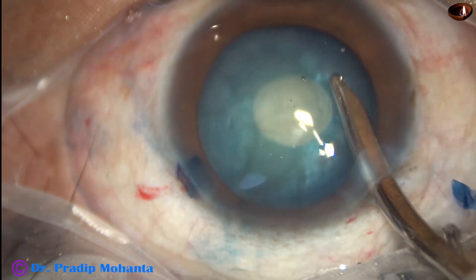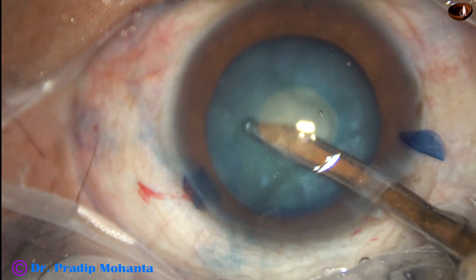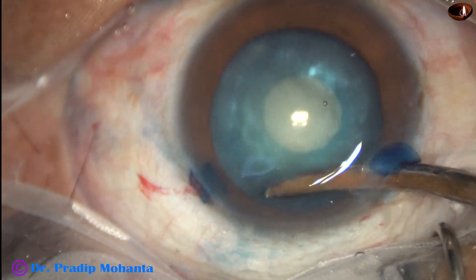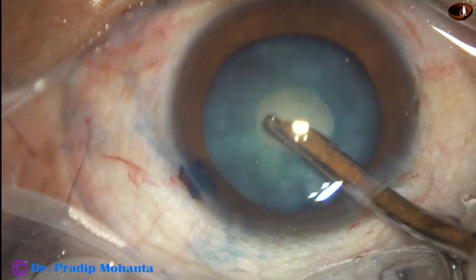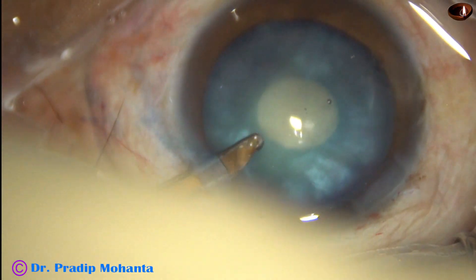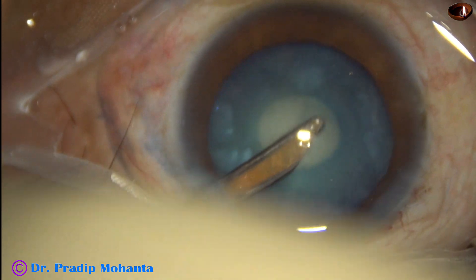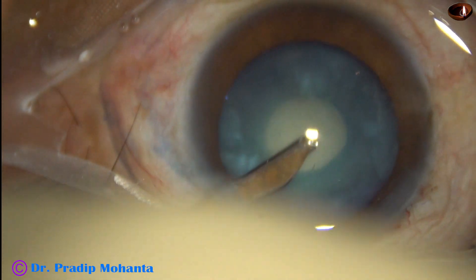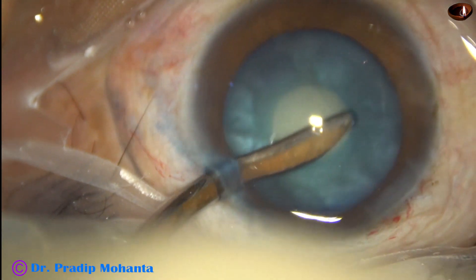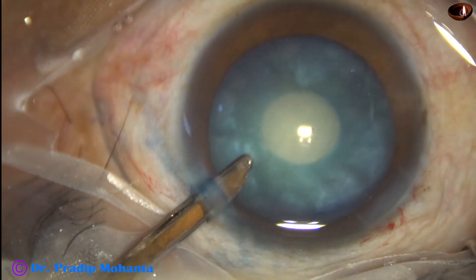In this case, I am milking away, milking out the cortex through the small opening. The cortical matter should be removed in such a way that there is no elevation. There is some elevation in the sub-incisional area; I am expressing that out.